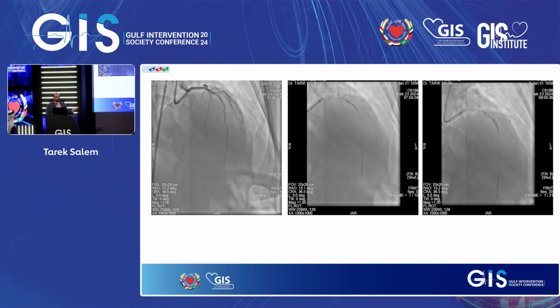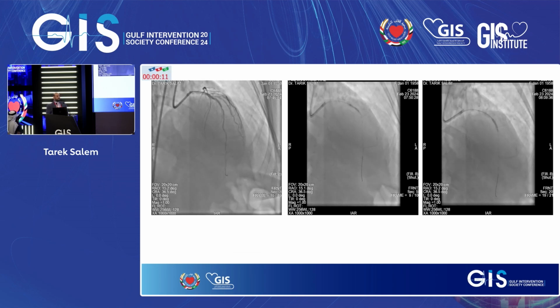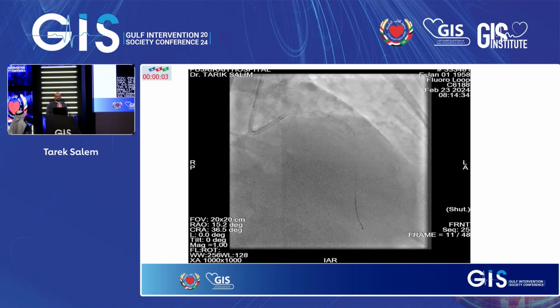Anyways, the patient came back to the cath lab. And at this stage, I acknowledge this is a nodular calcium that got my stent stuck and pulled it out. So on my next procedure, I used NC balloon, scoring balloon, cutting balloon, IVL, you name it. I've used it to prepare this lesion quite well, and we ended up with a good result. This is the stent on the second occasion.